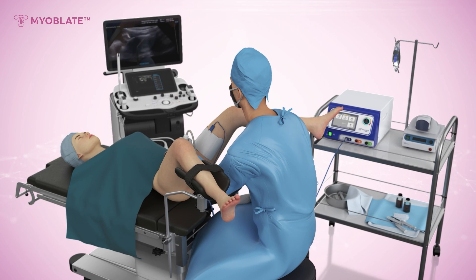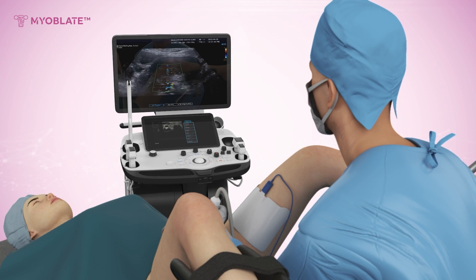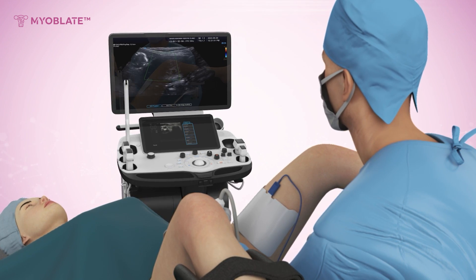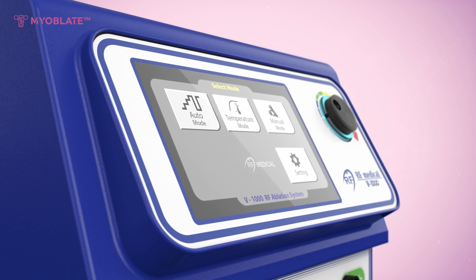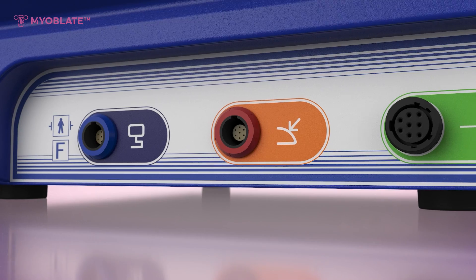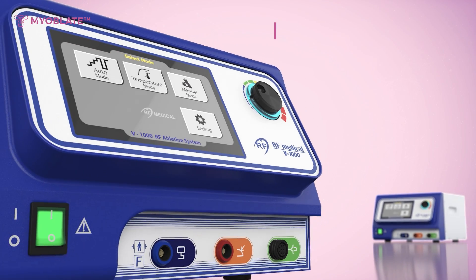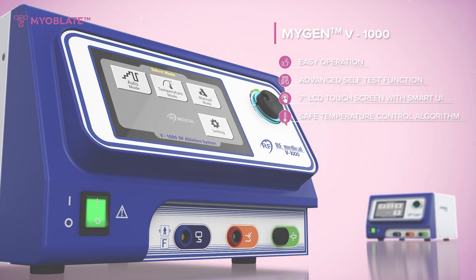Using ultrasound guidance, physicians accurately determine fibroid location and size while carefully selecting the appropriate treatment method. The radiofrequency ablation system differentiates itself with its compact and simple design while providing a variety of treatment modes. It is the only multimodal therapy for uterine fibroids, making the procedure easier, faster, and safer.